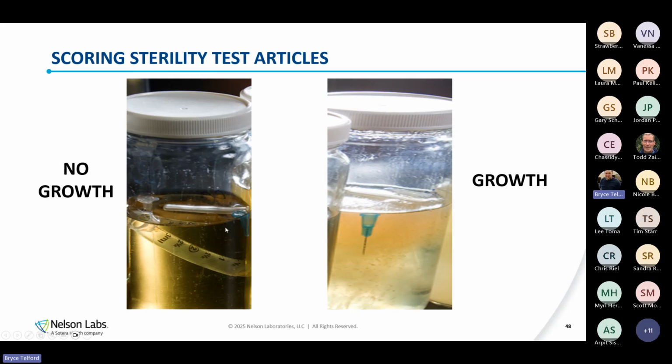So using this syringe example, if your sterility claim was only fluid pathway, that's fine that you're claiming that. But for testing purposes, we're going to have to immerse the entire thing, testing inside and out. And that's just something to be mindful of with the new revision of the standard, that we have that additional requirement when it comes to things like a fluid pathway claim of sterility.